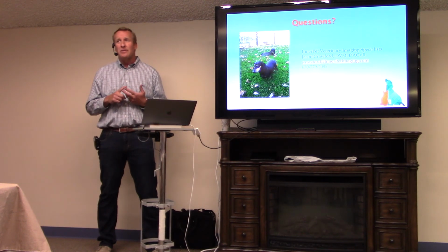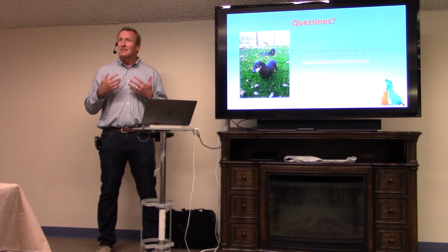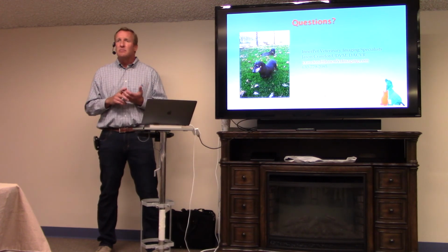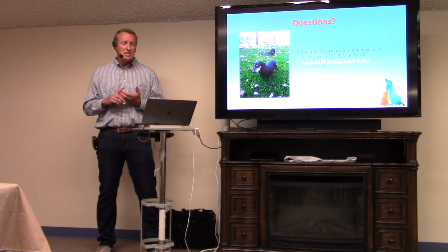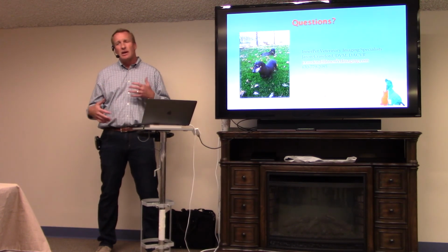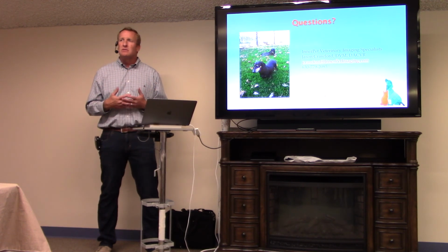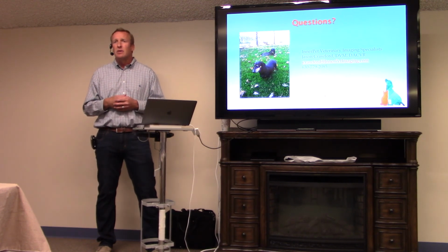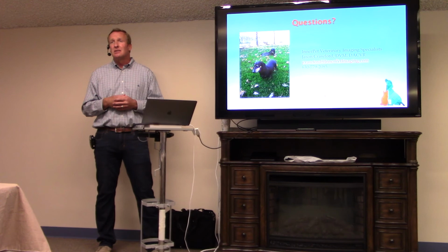Just getting the word out there and promoting CT more and talking to clients, and at least presenting it to clients and not making the assumption that CT isn't something that they're going to pursue, because I think when clients see the benefit of CT and getting a diagnosis quickly or more quickly than perhaps just repeating radiographs constantly or doing other types of studies that have been inconclusive, they might see the benefit of that. And so, yeah, it's definitely something that I've seen a large increase in demand in.